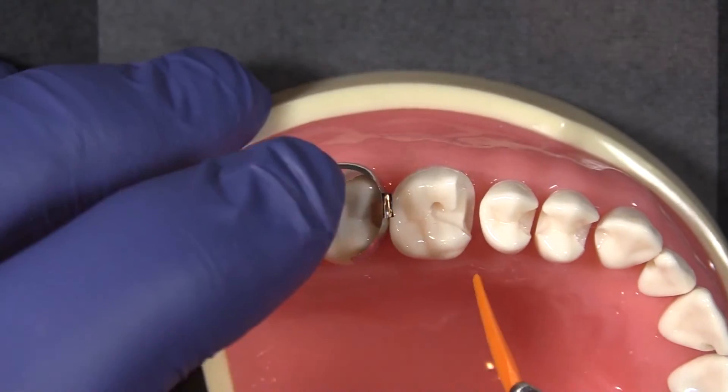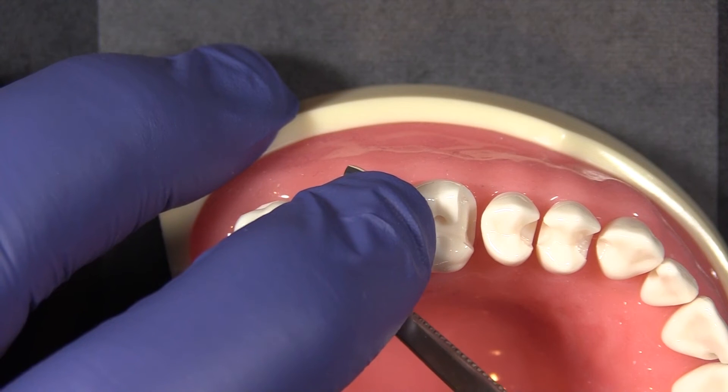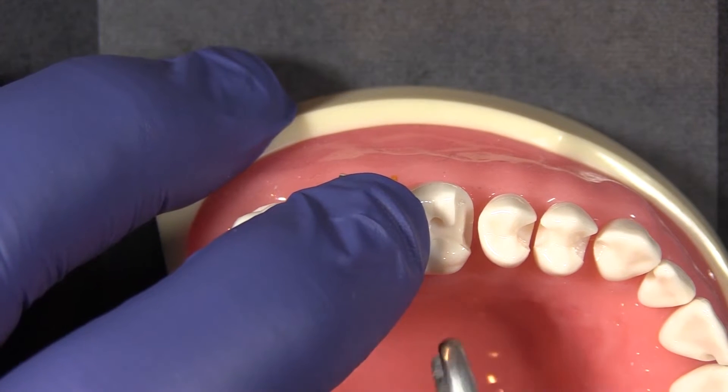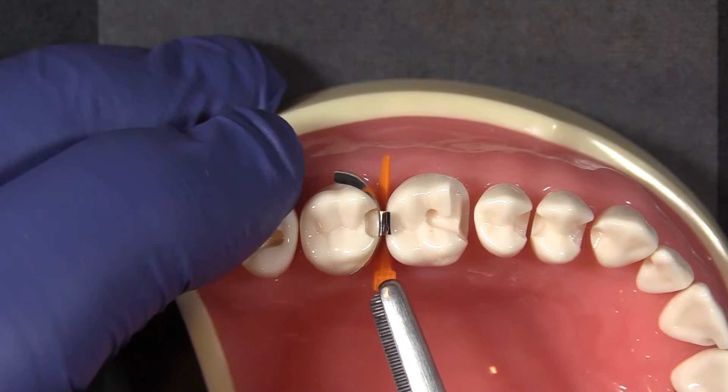In this case it really doesn't matter, so I'm going to wedge it from the lingual. When you go to place the wedge, make sure that you're holding your finger very firmly on top of the band to prevent it from becoming dislodged, and then drive that wedge all the way through the interproximal space.